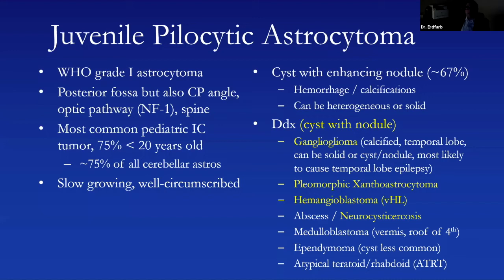There is a differential for cysts with nodules, and I think it's important to point out because we're not going to go through all these different cases, and some of them are dependent on age, some of them are dependent on location, like we talked about in the first slide of this lecture.